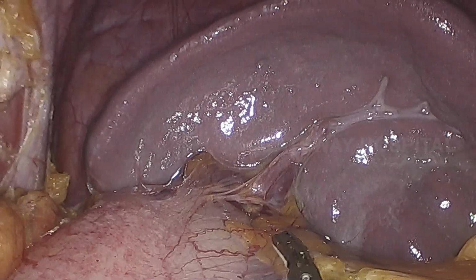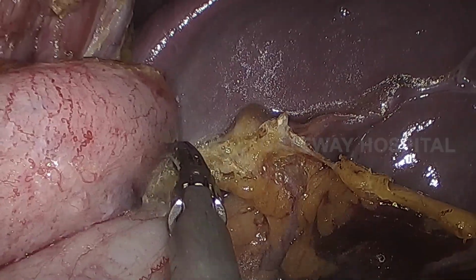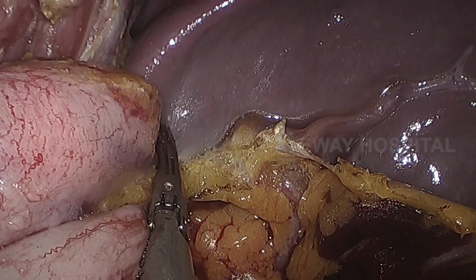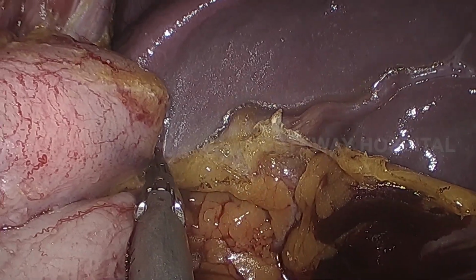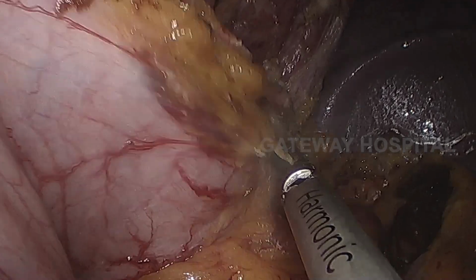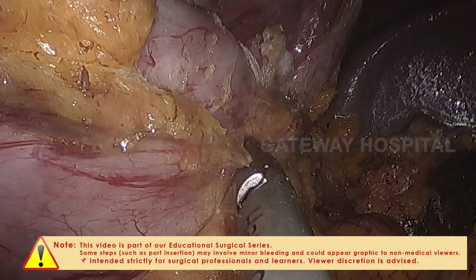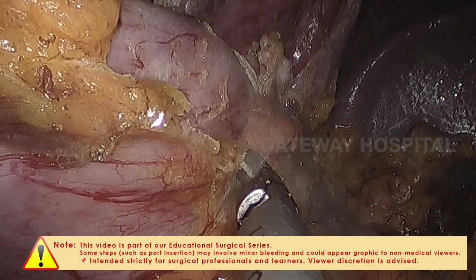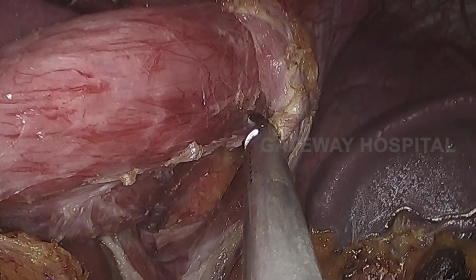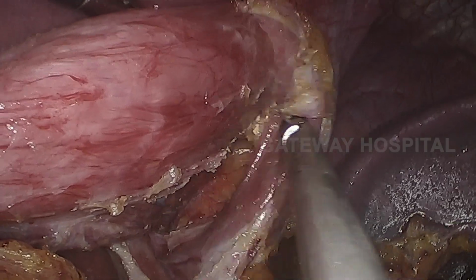While releasing the short gastric vessels, you should be very careful not to injure either the stomach or the upper pole of the spleen, because as you go towards the upper pole, stomach will be closely adherent to the upper pole of the spleen.